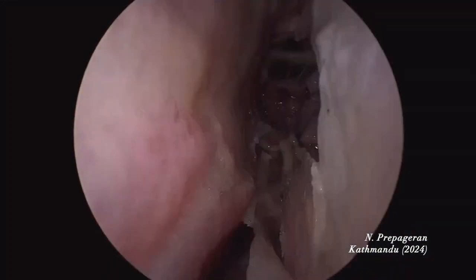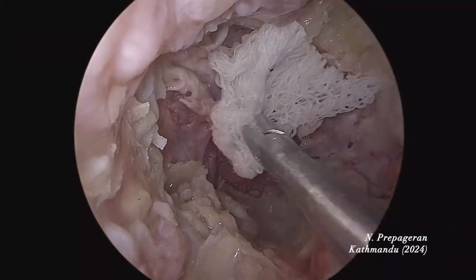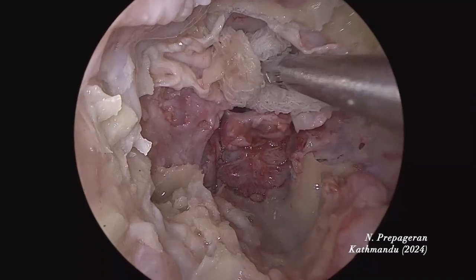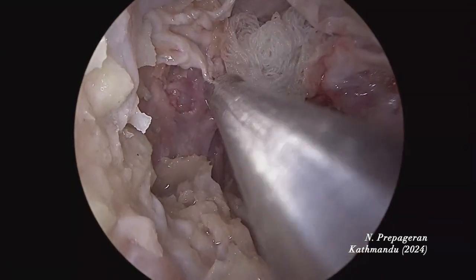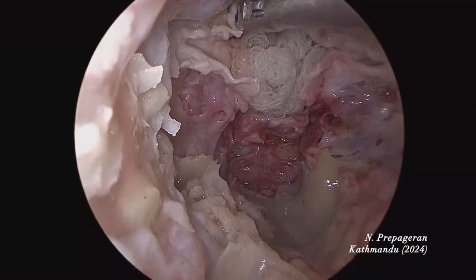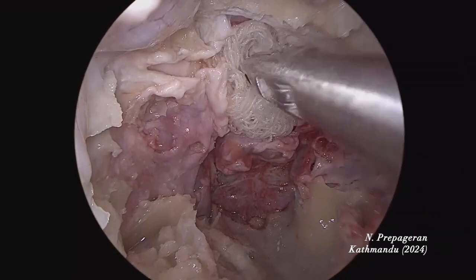Surgery is done. How do we reconstruct? The dissection must be done like how you do a surgery — only then does it become like a flight simulator, like how pilots train. Tumor has been removed — time to go home. I put a piece of fat or fascia lata, but I usually use fat. Push it into the edges. Then put the dura back. The dura that I opened just now. I've been teaching my courses this way for the last few years — teaching reconstruction as well. Push the dura back from the top and from below.